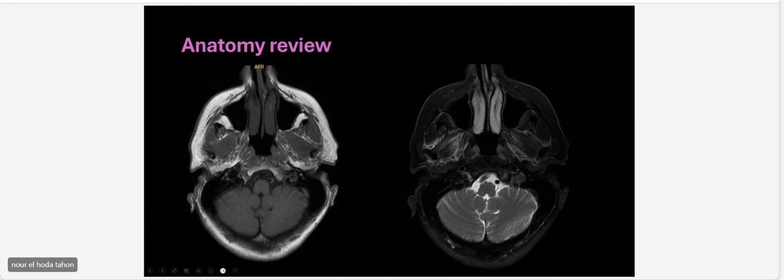And if fat is also high signal, it will be very hard to catch any lesion or differentiate between the tissues, right? So usually we use this technique in head and neck tumors. It helps us to see, because the head and neck has a lot of fat, and we have to suppress it so we can catch any small lesion of a few millimeters.